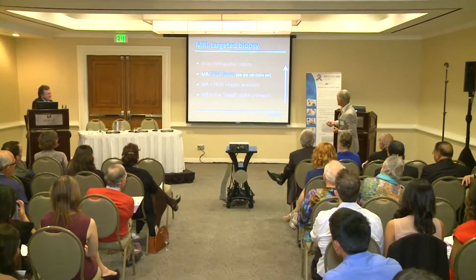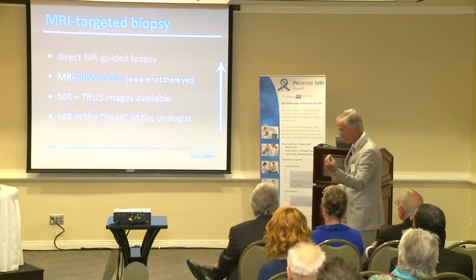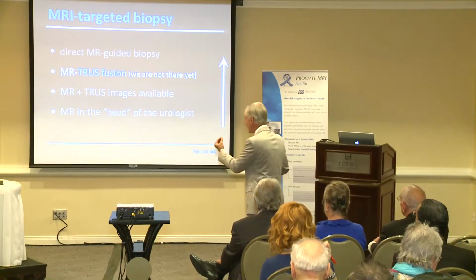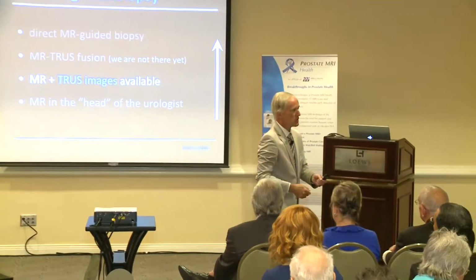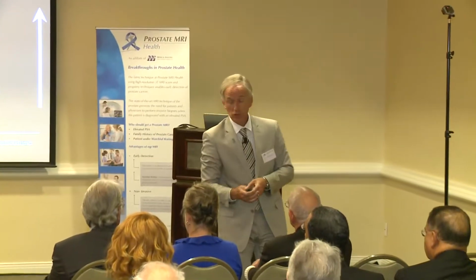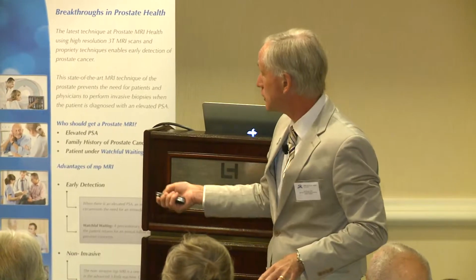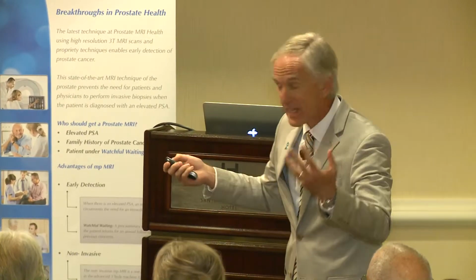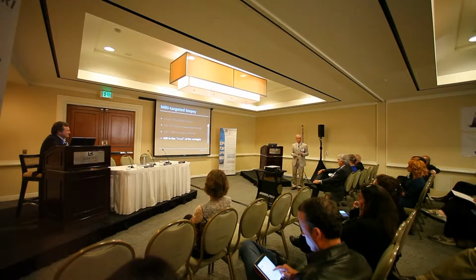Well, good news. We do have MR ultrasound fusion. However, the bad news is we are not there yet. It will be there, but not there yet. Or we can give you the MR. Say, okay, the MR is here. I stick in a needle, boom, boom, boom. So, MR TRUS image is available. Or we just can tell you it's at the anterior part, so that is MR in your head. That is what we call cognitive fusion. And you can understand that the accuracy is increasing from here to there.